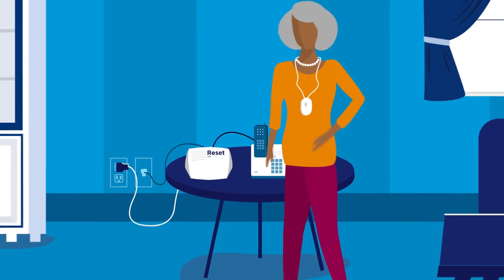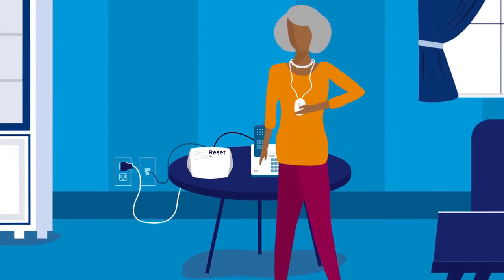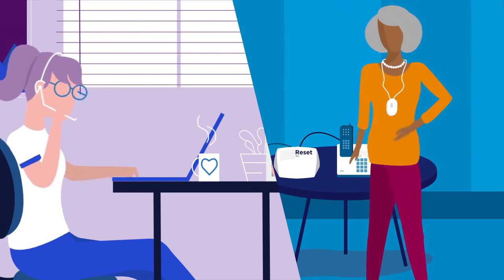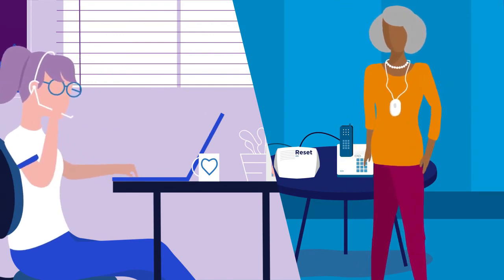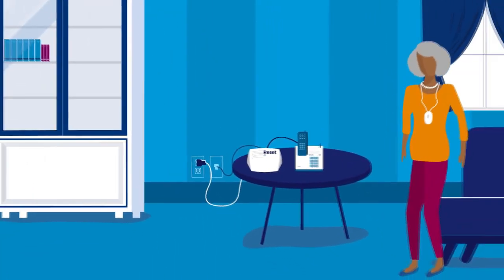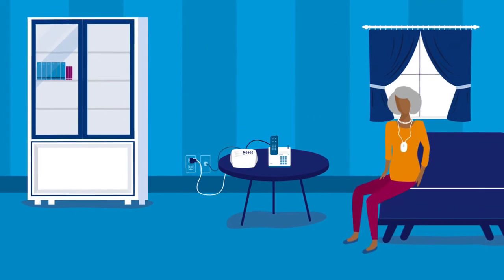Then press the help button you're wearing. This will connect you to a Lifeline training care specialist. They will confirm your setup and answer any questions you may have. That's it. You're now ready to experience 24-7, fast, easy access to Lifeline whenever you need it.